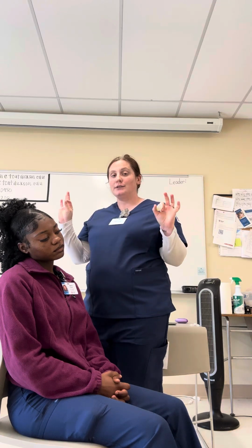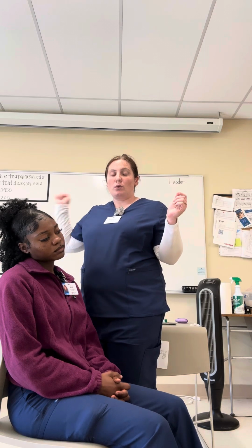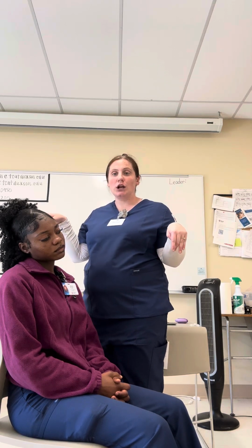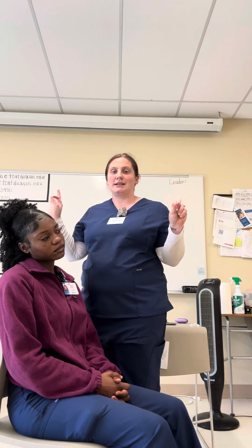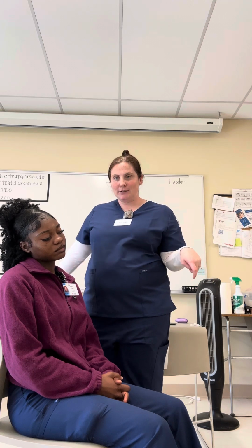I'm going to put my gloves on. And then, since she is over the age of 3, I would take her ear and pull up and back. If they're under the age of 3, you're going to pull down and back. If they're above the age of 3, you pull up and back. For below the age of 3, it's down and back.